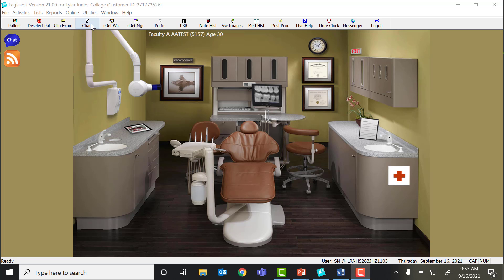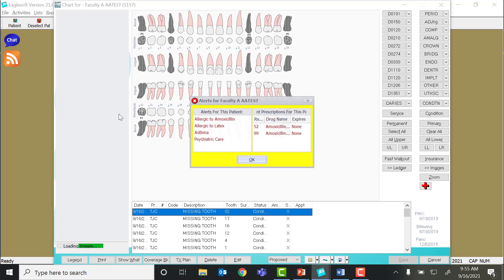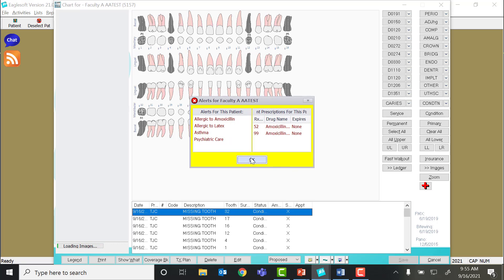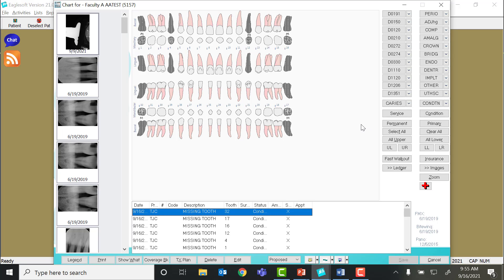The first thing you're going to want to do is make sure that you have removed all the teeth that this patient has missing from their dental chart. We're going to say that this patient is missing all four wisdom teeth as well as their second premolars on the maxillary.